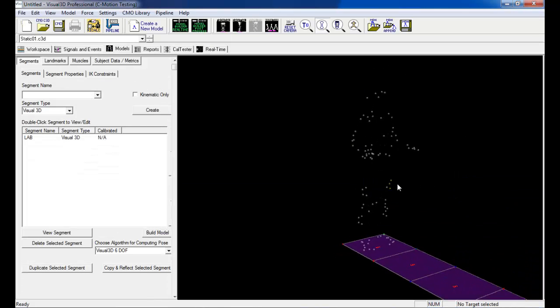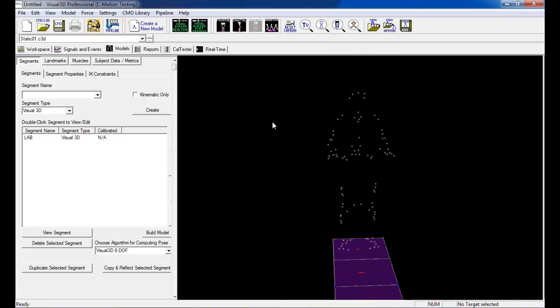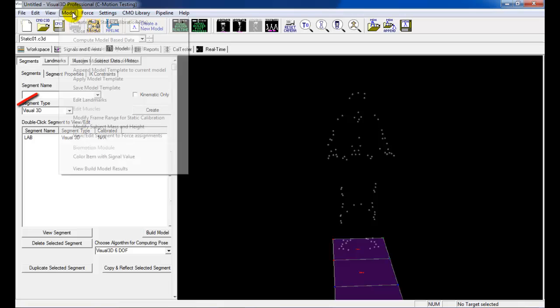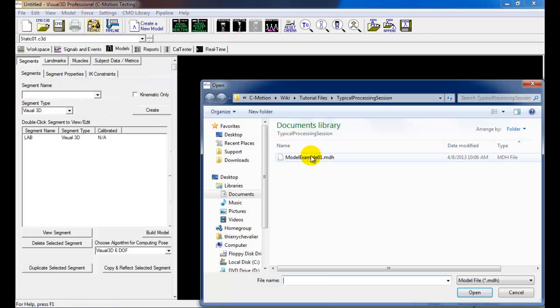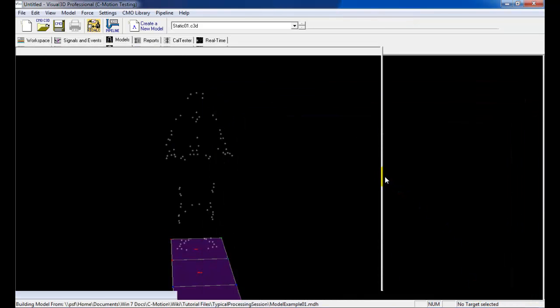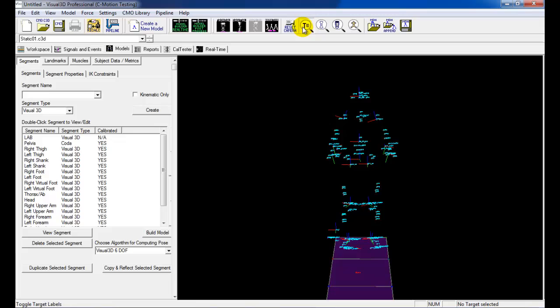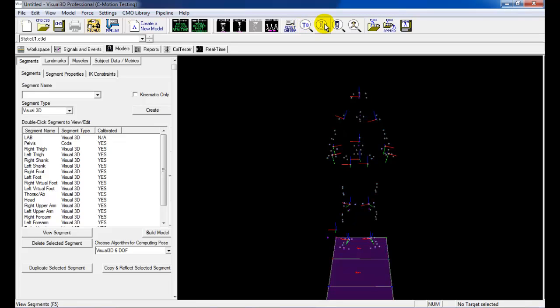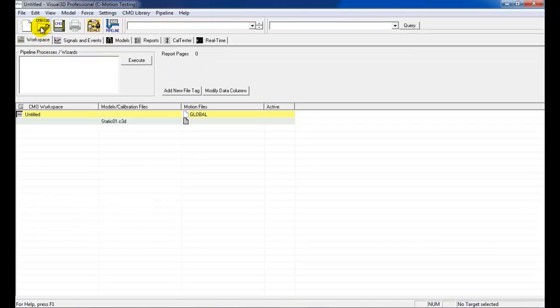The model template can now be applied to the static trial. To load the model template, select Apply Model Template found under the Model menu. Select the correct MDH file and click Open. The model template includes the definition of each segment's coordinate system and corresponding tracking markers. It also includes the subject data and metrics, such as mass and height.